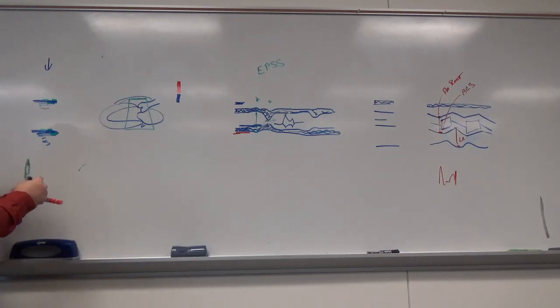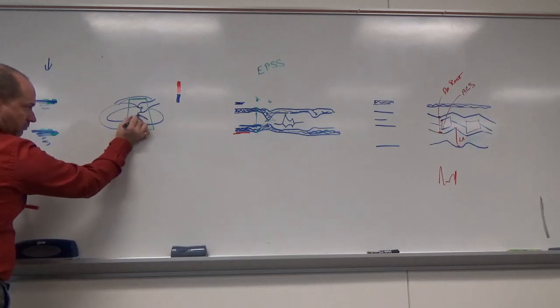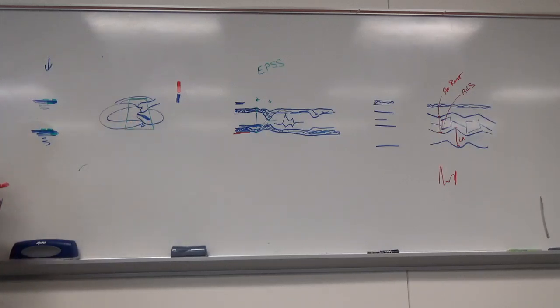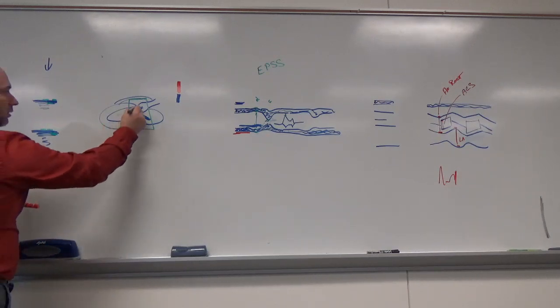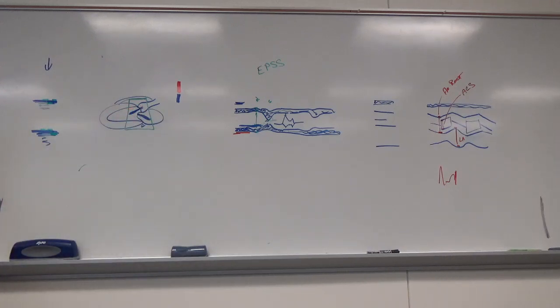And if I see leaky valves, it's going to be typically blue away, jet going back into the mitral that way, or I guess these will both be in blue because it's going to come back this way out of the aorta. They actually get blue and red because they alias a lot, and it's going to look kind of a mixture of stuff there. But that's what I'm looking at.